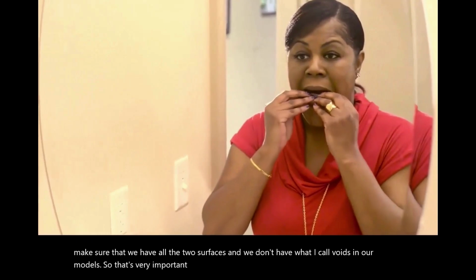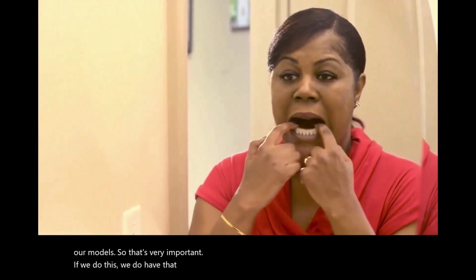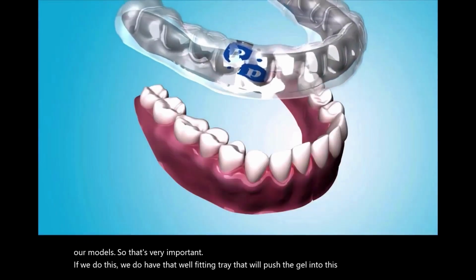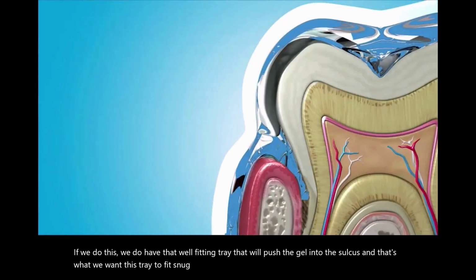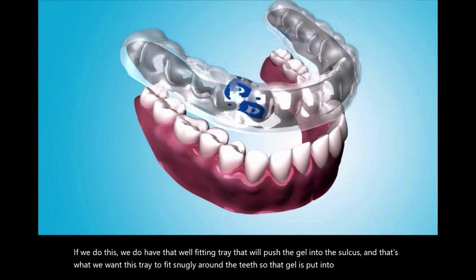If we do this, we do have that well-fitting tray that will push the gel into the sulcus, and that's what we want. We want this tray to fit snugly around the teeth so that that gel is put into the deep areas of the sulcus.